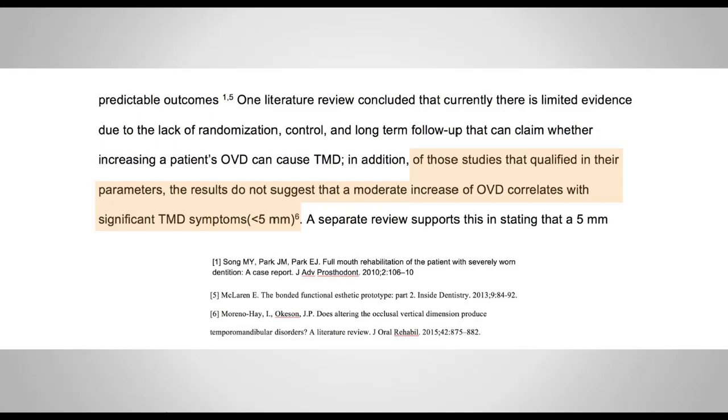The downside to the splint is that it does its job, but the patient needs to wear it. And the problem is compliance. Patients don't like wearing it, and if they don't wear it, you don't get the information that you need. The only other, very aggressive option that you may have is to prep all the teeth and fabricate your temporaries at that new vertical dimension.